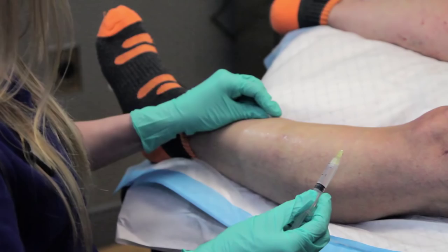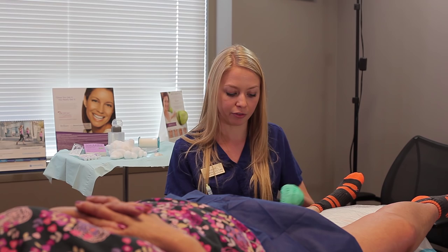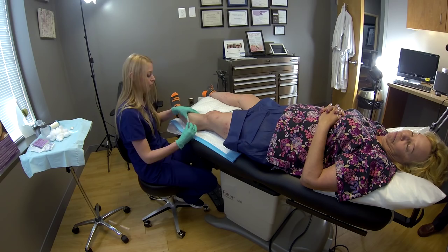Normally in one session of sclerotherapy you can get pretty much both legs done depending on the amount of spider veins that you have. I normally do a 30-minute treatment, and in that amount of time I can normally get everything done on both legs.